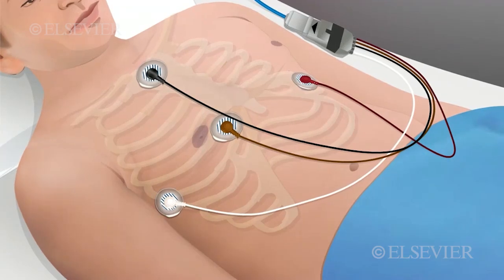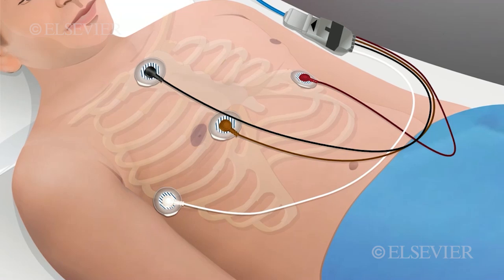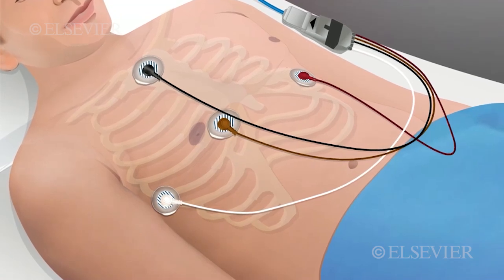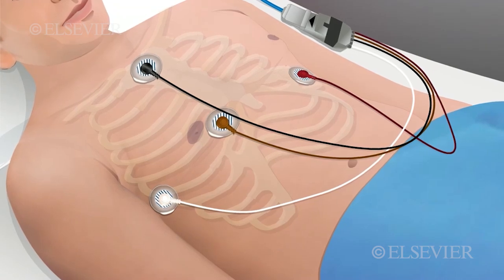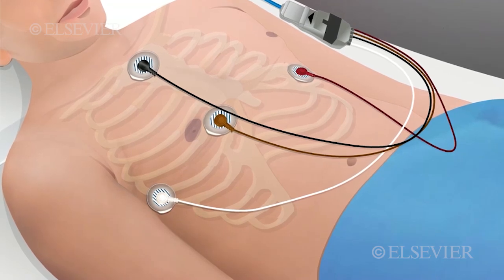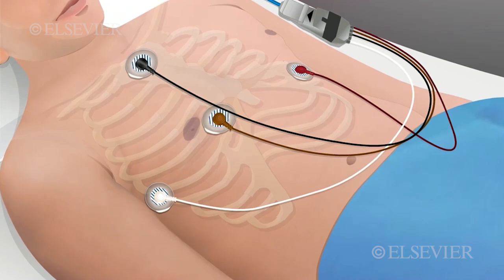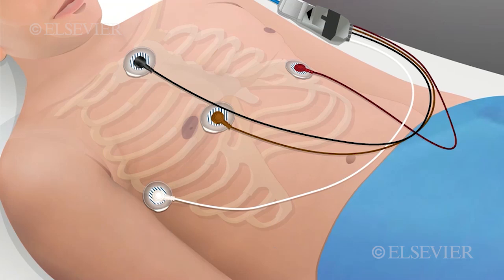EASI system lead placement. Place the E brown electrode on the lower part of the sternum at the level of the 5th ICS. Place the A red electrode on the left mid-axillary line at the level of the 5th ICS. Place the S black electrode on the upper part of the sternum. Place the I white electrode on the right mid-axillary line at the level of the 5th ICS. Place the 5th ground electrode anywhere on the patient's chest.